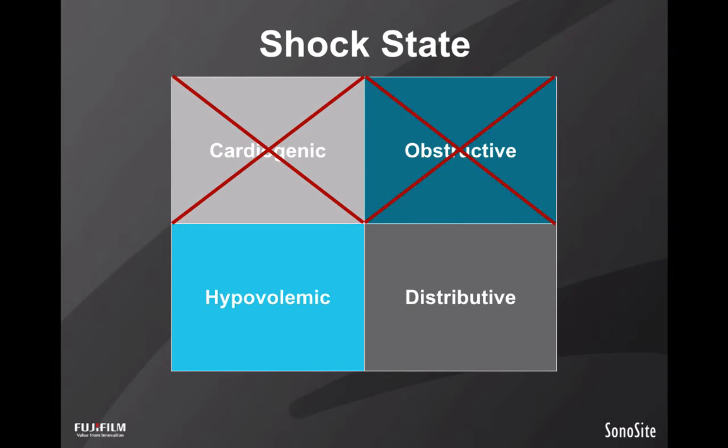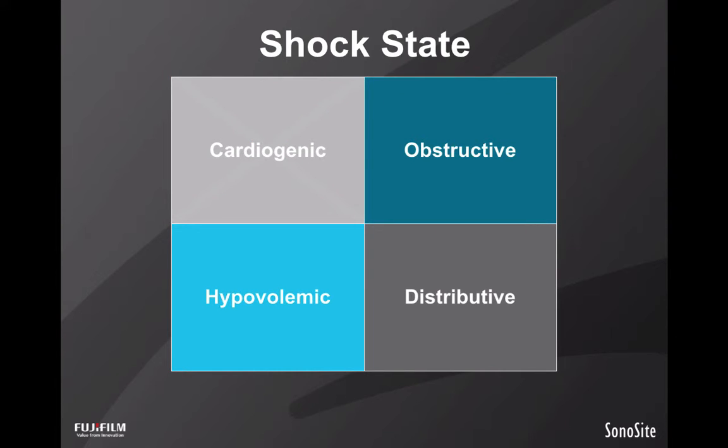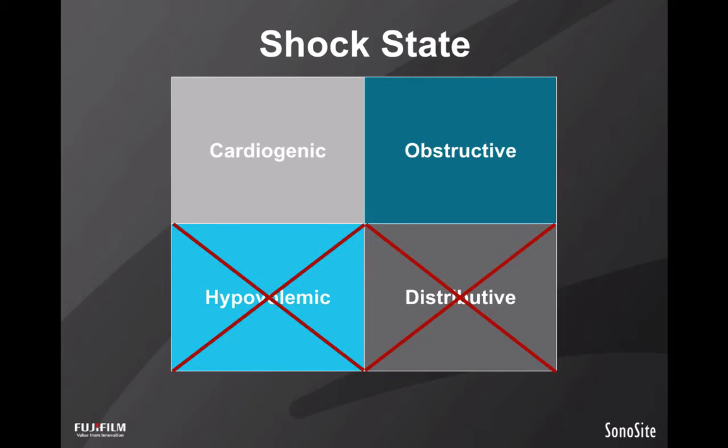So your next step is to look for fluid where it doesn't belong, and in the right patient, you may also look for aortic emergencies. Looking at the pump, you may see a hyperdynamic heart, confirming what the IVC told you. And as you resuscitate with fluids or blood, you can repeat the IVC exam to make sure we're seeing it fill appropriately. Now, if the IVC is distended and not collapsing, hypovolemic and distributive shock are unlikely.